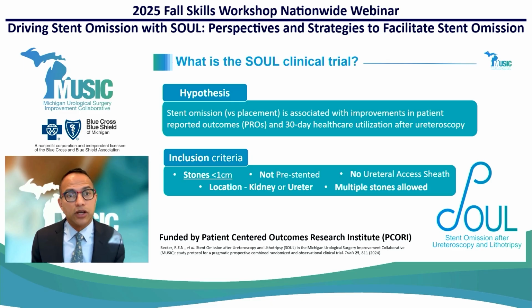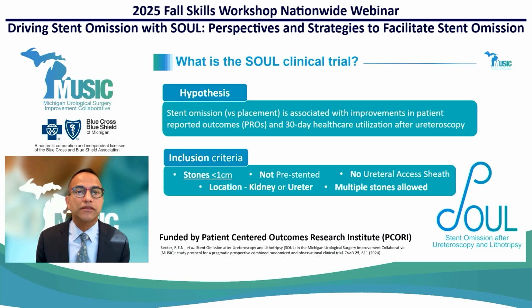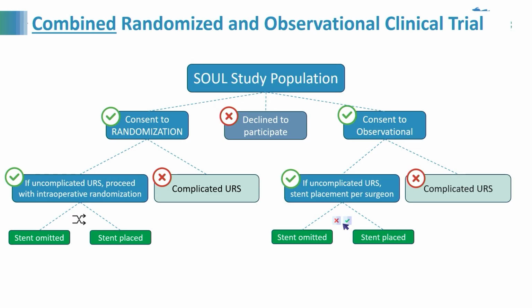We are looking at stones less than 1 centimeter in non-pre-stented patients without using an access sheath. And this is the type of patient that we consider would undergo an uncomplicated procedure.